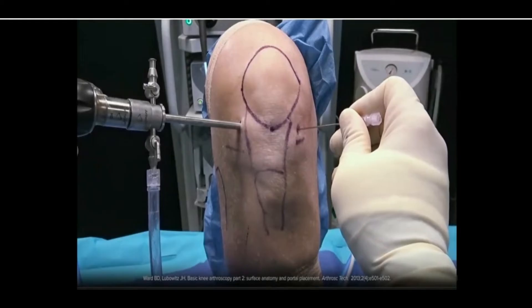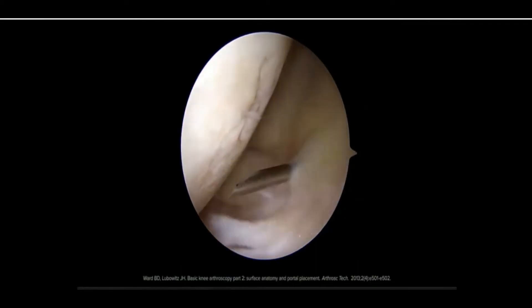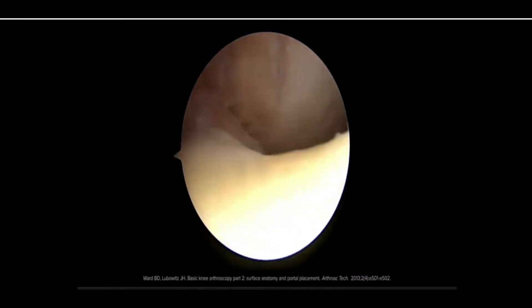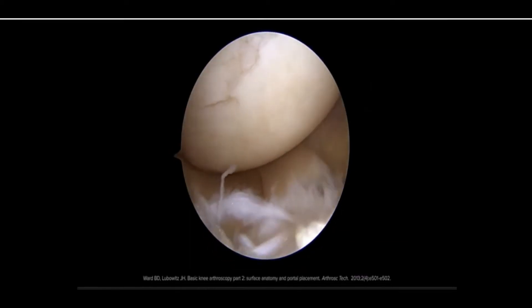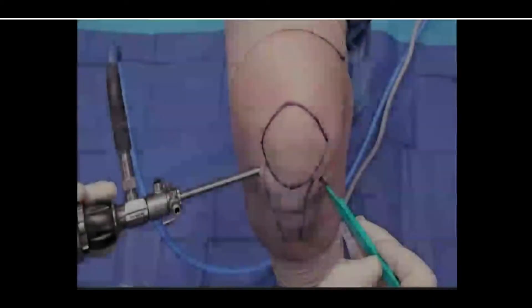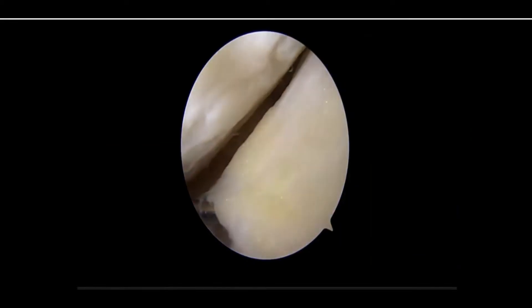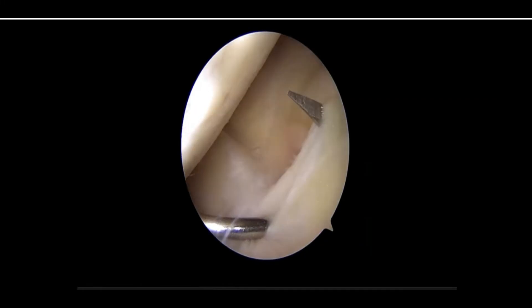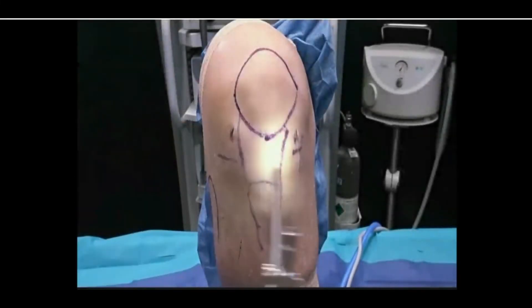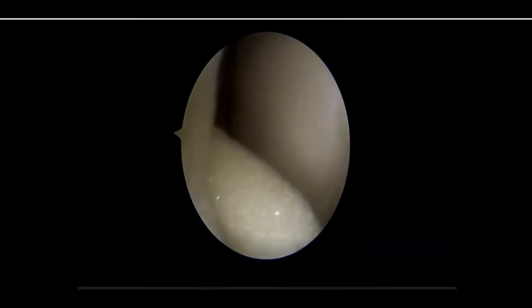Place the anteromedial portal under direct visualization by first targeting with a spinal needle to ensure that the portal placement allows the pathology to be reached and that the anterior aspect of the medial meniscus will not be injured during portal placement. Often, the lateral portal is used to visualize the procedure while the medial portal is mainly used for instrumentation. Depending on the pathology, these portals may both be used for arthroscopic instruments as well as to place the arthroscope for viewing.